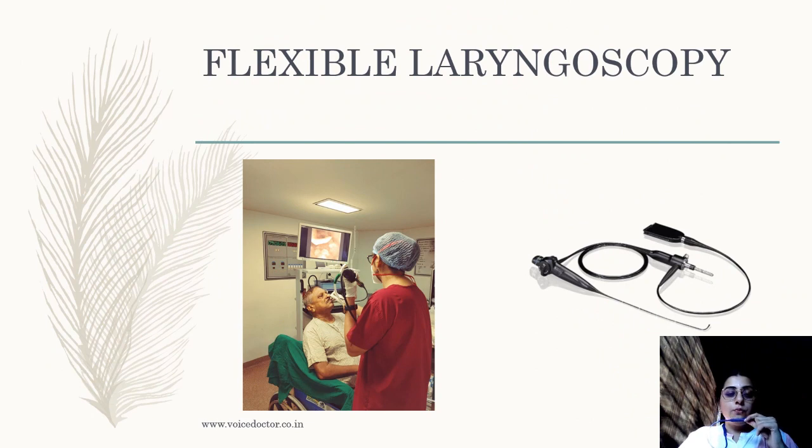So then moving on, we have the flexible laryngoscopy system. This is my personal favorite, and this is how it looks on visualizing the scope. And on the left side you can see me doing the procedure. The patient is seated comfortably in the minor procedure room, and I've inserted a small scope through the nose. The patient is very relaxed. I don't have to give any anesthesia to the patient. The patient is comfortably sitting in front of me, talking with me, and I put the scope through the nose, behind the nose, mouth, throat, and that's how I visualize it.